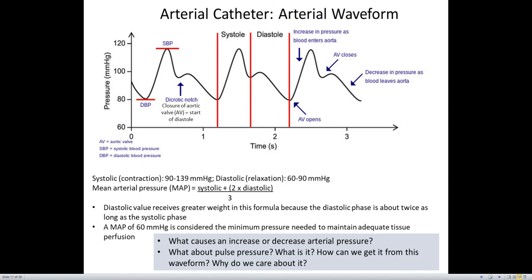So you can see it continue to go down until we reach that bottom wave, and then it goes back up to systole. Okay. When you see the very bottom part of diastole, right before we peak to systole, you see an arrow that represents AVO, the aortic valve opening. It has to open in order for us to inject blood into the aorta.